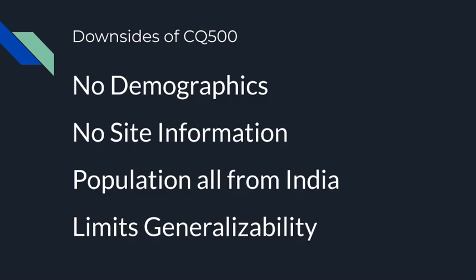Some of the main downsides of the CQ500 compared to other templates is that no clinical or demographic information is presented with the data, which limits generalizability of the template. The population, to our knowledge, is exclusively from India, and it's unclear the number of sites the patients came from. We may connect with the group for a collaboration, as they have the information.